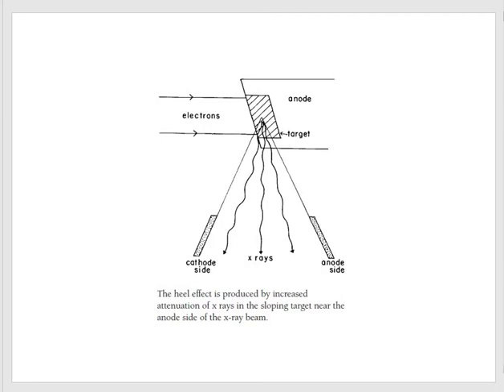As the electrons are accelerated towards the positively charged anode, through Bremsstrahlung or characteristic ways of producing X-rays, the electrons will hit the target. Although only 1% of the electrons produce X-rays, most of the electrons just hit the anode and produce heat.